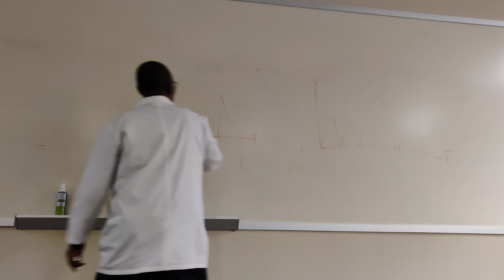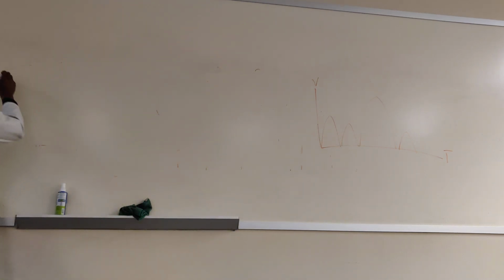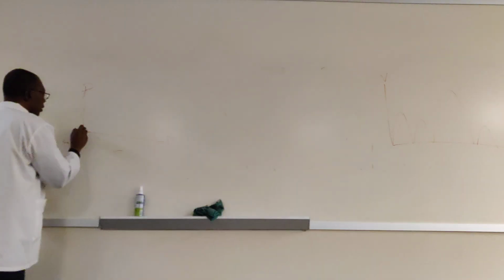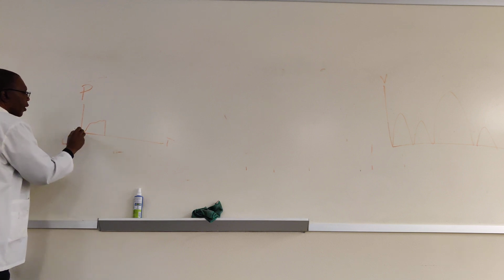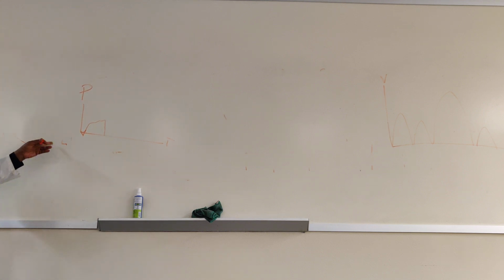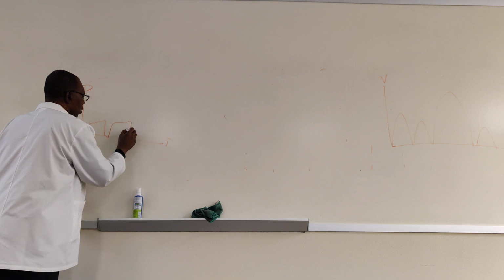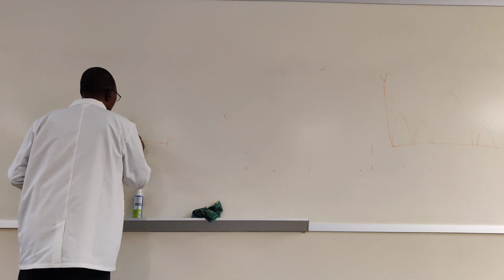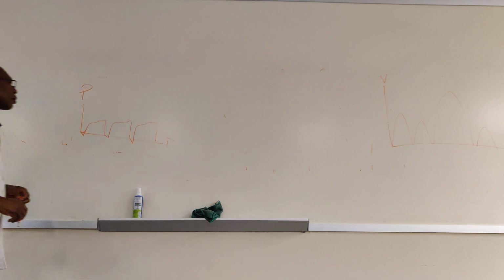So on that one, pressure time curve usually looks like this. Of course, it's going to have that indentation because that's a spontaneous mode. CPAP is a spontaneous mode. Like that. Okay?